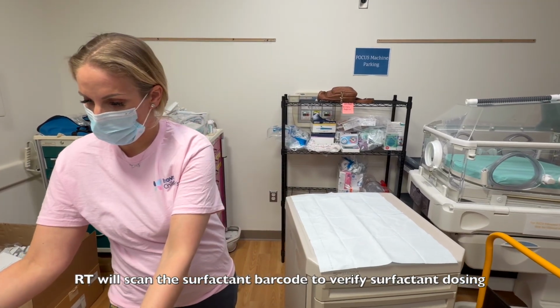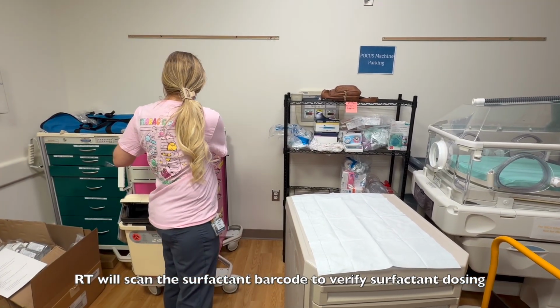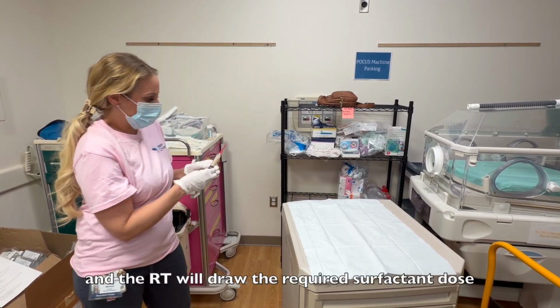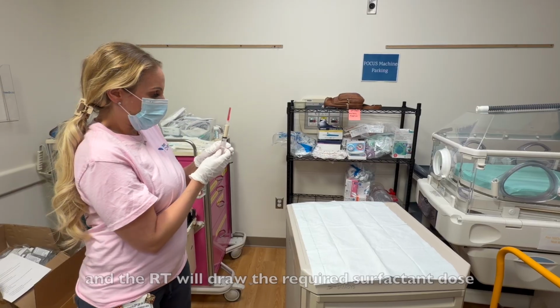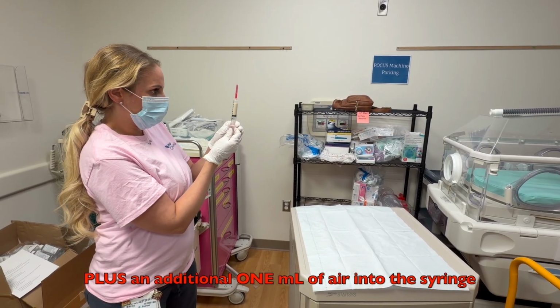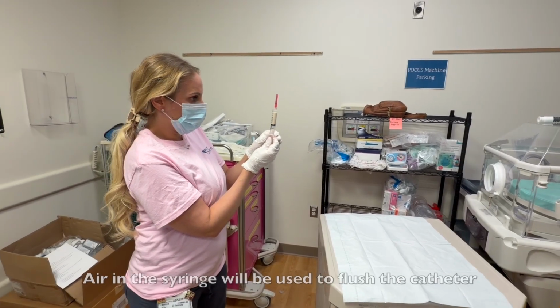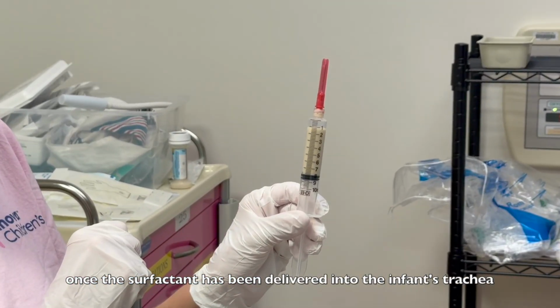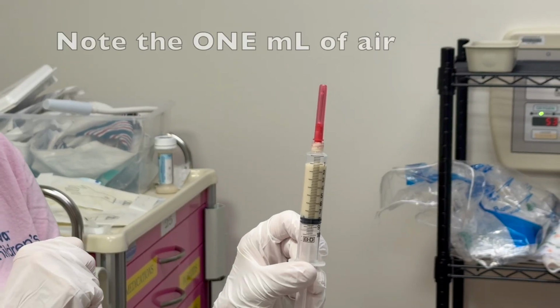RT will scan the surfactant barcode to verify surfactant dosing with the MAR on Epic, and the RT will draw the required surfactant dose plus an additional 1 ml of air into the syringe. Air in the syringe will be used to flush the catheter once the surfactant has been delivered into the infant's trachea.